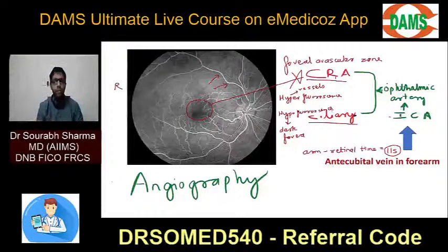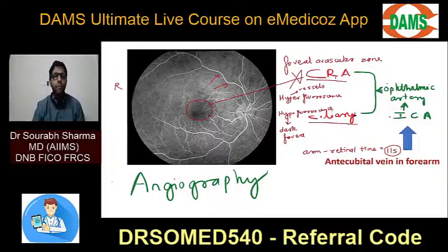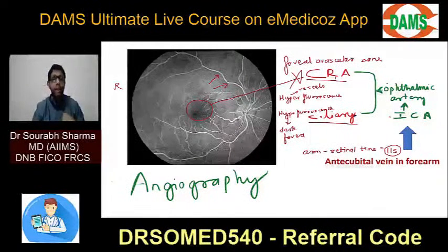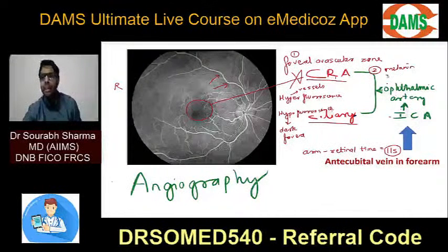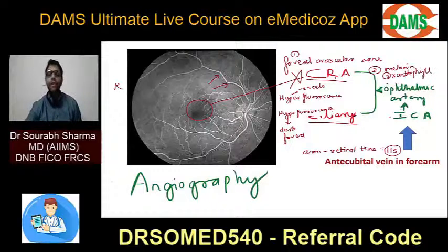Sir, but the fovea is very important, sir. How is the fovea getting nutrition? From the choroid, of course. Sir, but in the choroid, everywhere we can see dye. Why can't we see dye behind the fovea? Very good question. Yes, there is dye behind the fovea also, but we can't see it. Why? I told you, highly pigmented melanin and xanthophylls are present at the foveola.